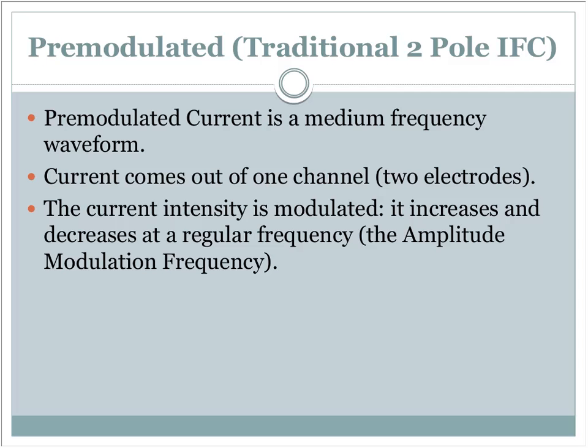You can do a knee and an ankle. You can do an ankle and an elbow. You get the idea. The current intensity is modulated, which is nice. That's why it says premodulated. It'll increase and decrease and widen and narrow in a predetermined way.